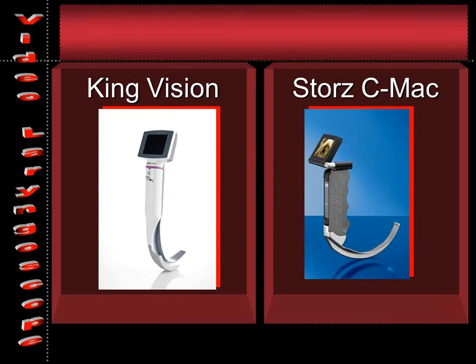King Vision, what you guys have here. Anyone seen the Storz C-MAC before? So this is about $3,500, $4,000. Of course, the King is about $1,000. The good thing with the Storz though is it's reusable, versus the King, where the bottom part gets thrown away.